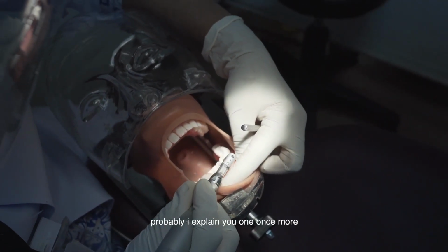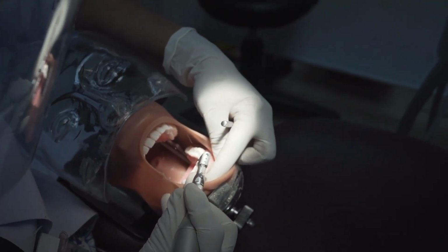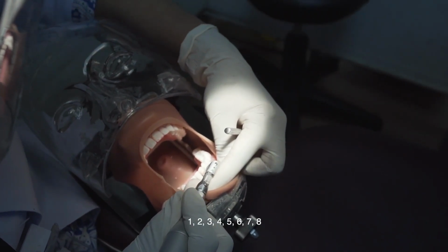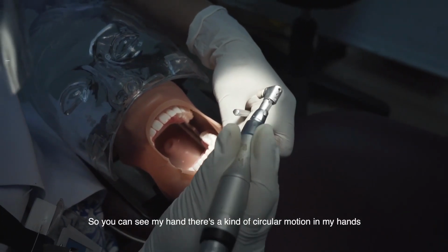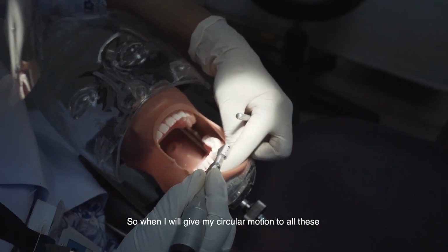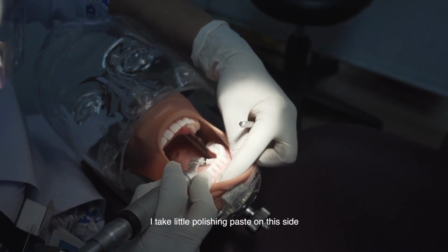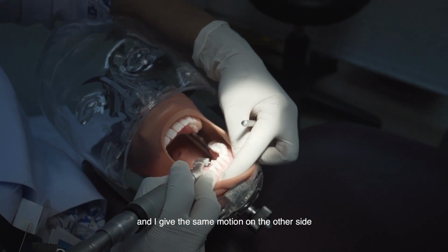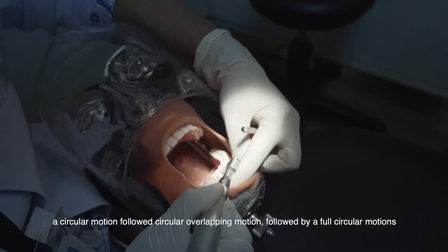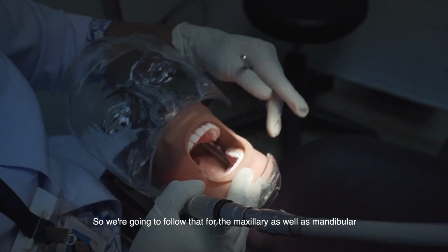Probably I'll explain once more. I'm going to divide it into 9 different quadrants: 1, 2, 3, 4, 5, 6, 7, 8. You can see my hand, there is a kind of circular motion in my hand. I will give my circular motion to all these 9 different quadrants on the tooth surface. The same way, I take a little polishing paste on this side and give the same motion on the other side too. A circular overlapping motion followed by a full circular motion to polish the teeth. We are going to follow that for the maxillary as well as the mandible.